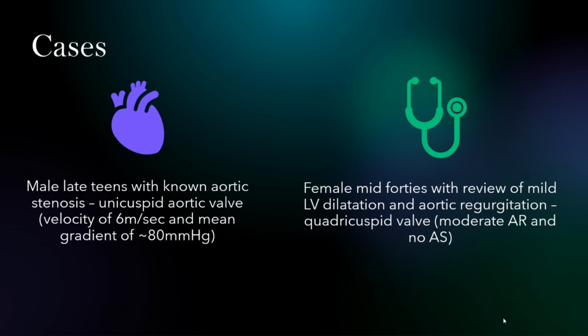regurgitation with her quadricuspid valve. In comparison, she did have moderate AR but no significant aortic stenosis.